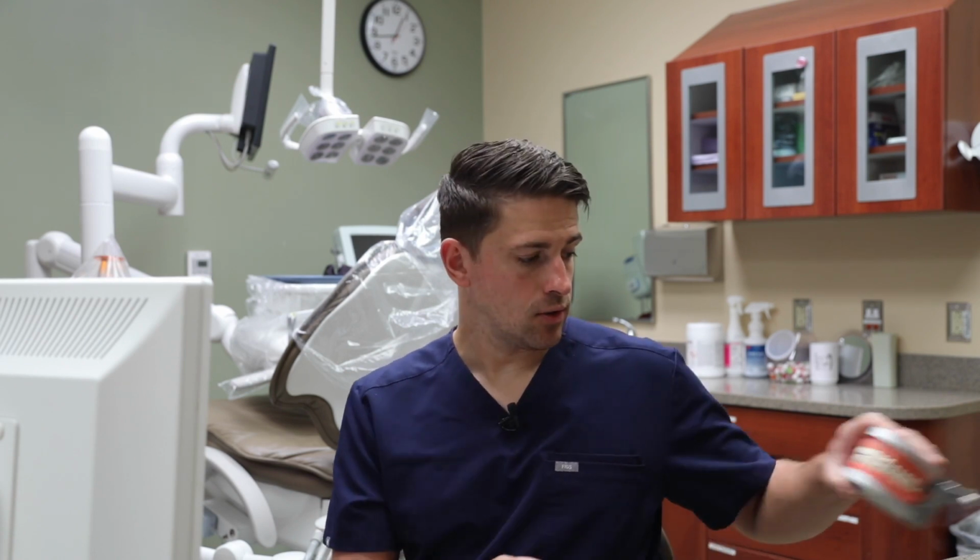But the goal is to create a shade tab that is of different shades of that material. So, you know, an A2 on the Vita Classical Shade Guide may not be a perfect match to an e.max restoration fired as an A2. And so that's the kind of thing that is helpful, is I can take these restorations we milled and I can kind of confirm the shade of the restoration before I commit to all the lab work of creating that. There are some little flaws there, okay?